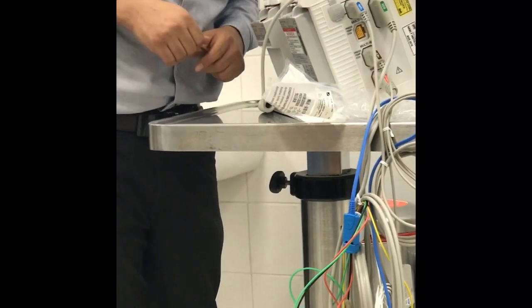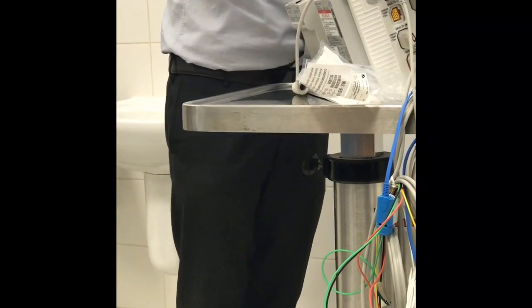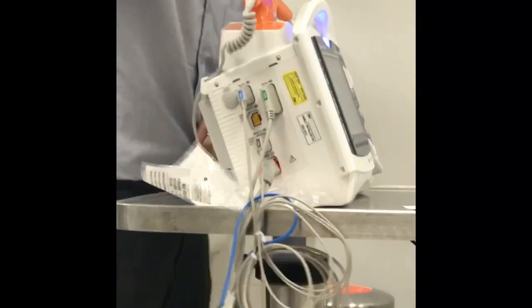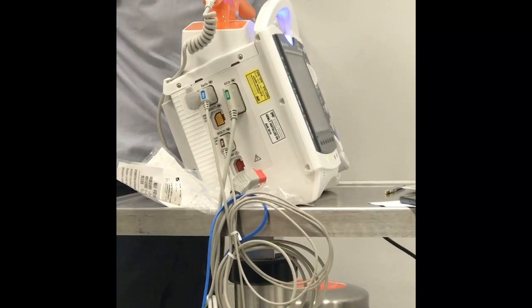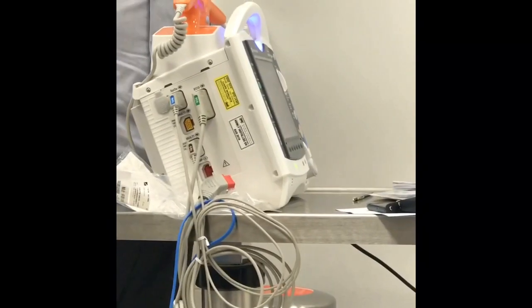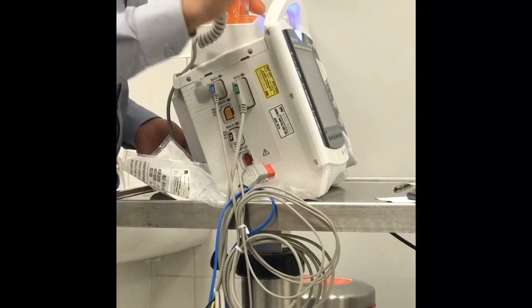If I use a battery, what is the duration? Four hours of battery, that's the maximum. Okay, four hours maximum, with charge and discharge. Of course, if you are using it as a monitor, it will be more. If the battery is used for shock, it can be 70 shocks with the maximum joule, 270.